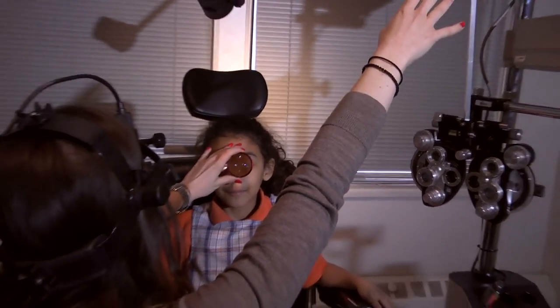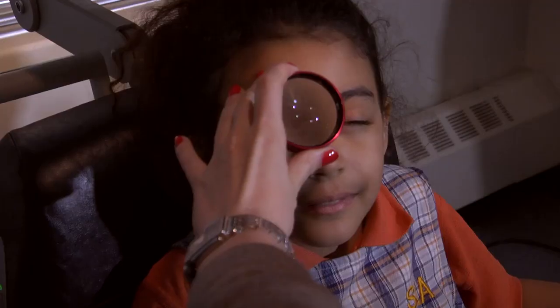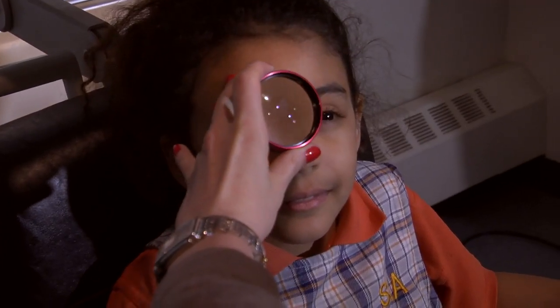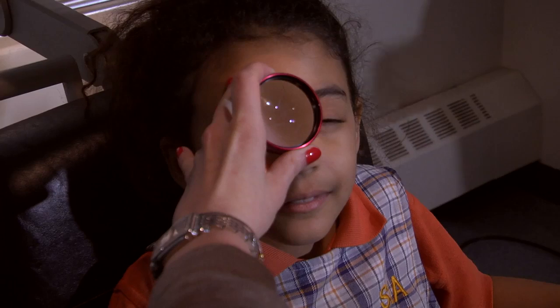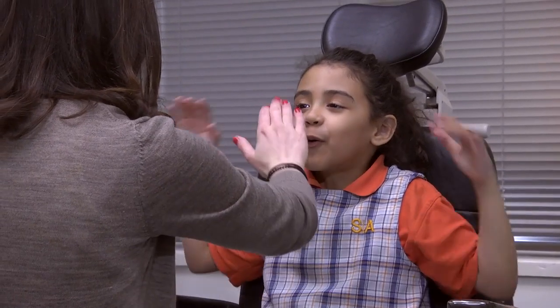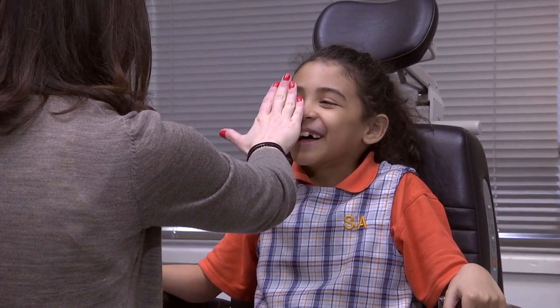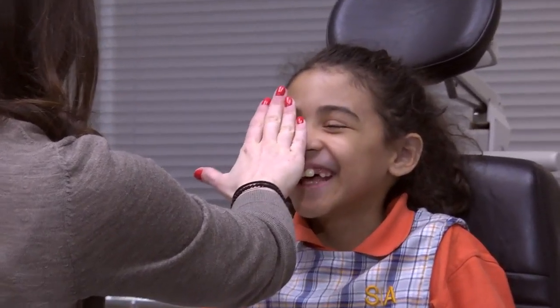There are plenty of diseases that we can find in the back of the eye that you may not have known about, and we can also look to see just the general health of the child based on this exam finding. Once this test is over, we go over all of the exam results, including whether the child will need glasses prescription and how healthy the child's eyes are.